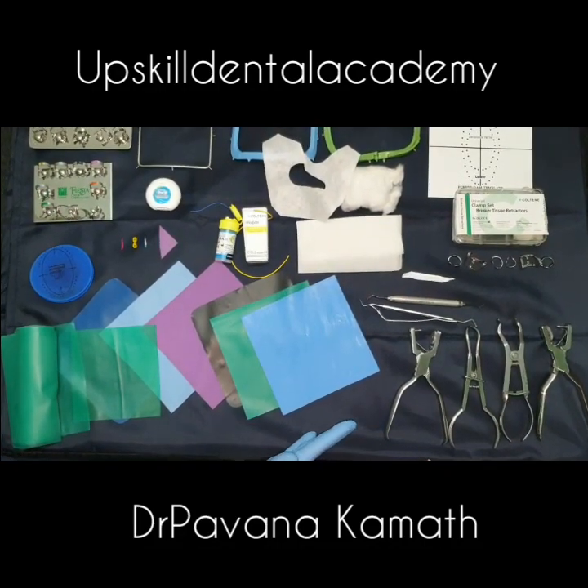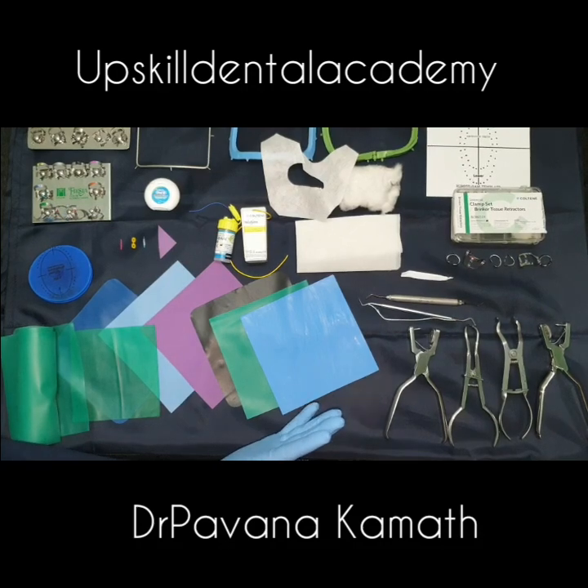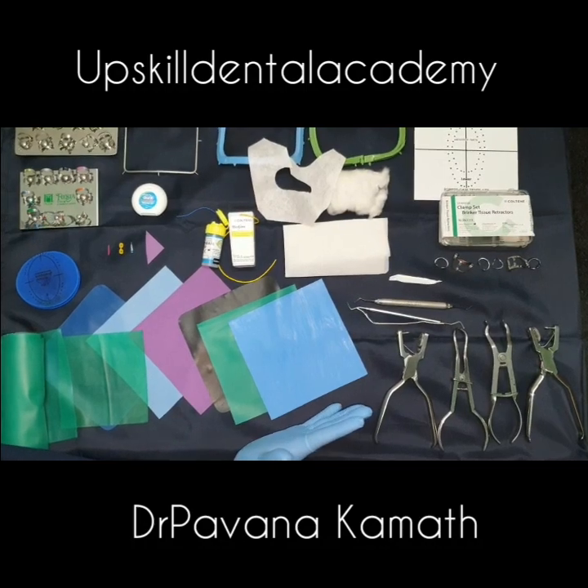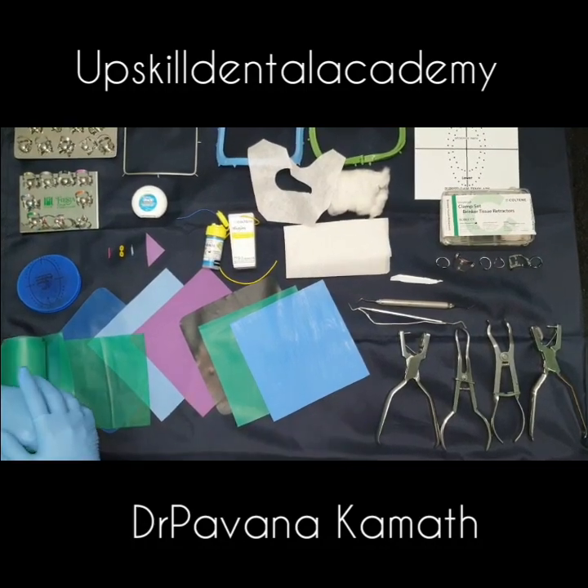So this is a summary of all the rubber dam materials that we would be needing for performing a rubber dam application. We will now talk about each item in detail — let us begin.